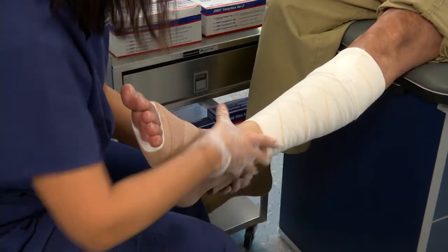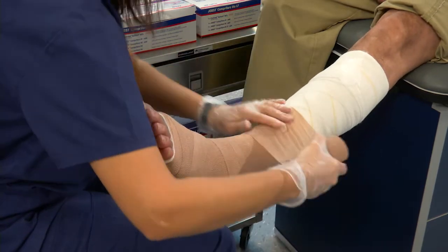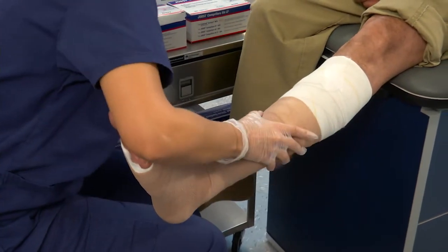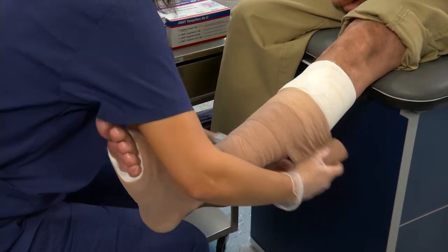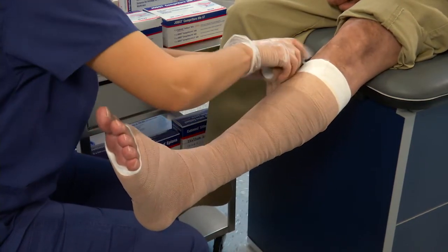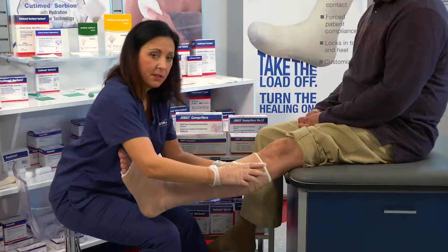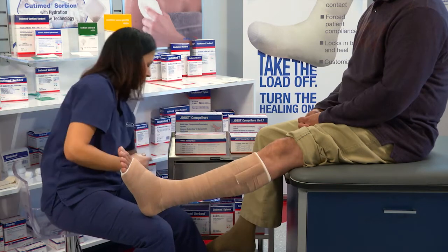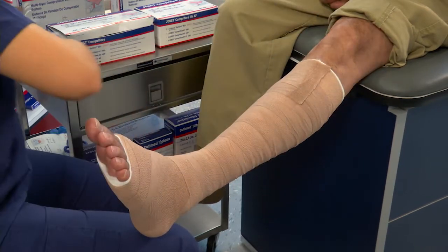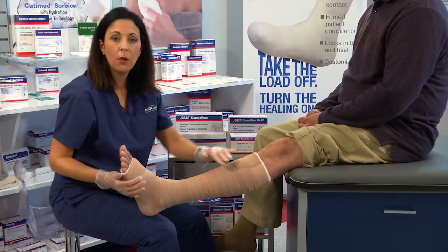Then we're going to begin our spiral up the leg with a 50% overlap, smoothing out any wrinkles as we go. I'm pulling 50% to ensure that I have the proper compression. When we get to the top, we want to make sure to cut off any excess bandage. This is a cohesive bandage and will stick to itself. This completes our wrapping of Jope's Comprofor.